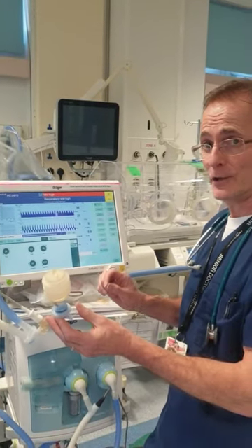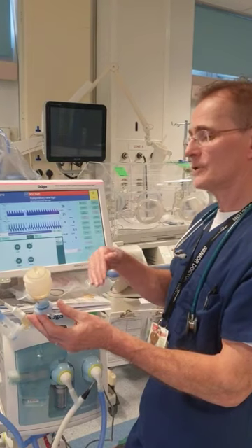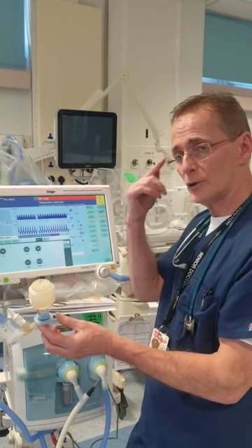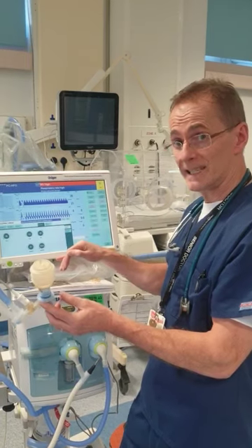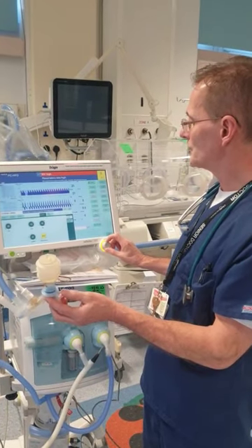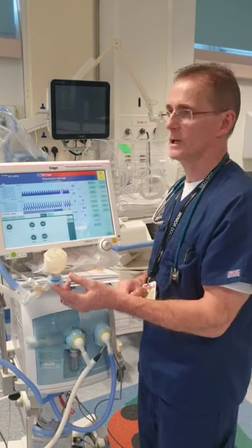The next thing to do is to bring down the mean airway pressure until such times that we see that the baby desaturates again. And then you'll quickly put it back up again. But take note of the pressure when the baby is desaturating, because that's the so-called closing pressure. So now I press the mean airway pressure. I'll drop it by 1 or 2 centimeters.